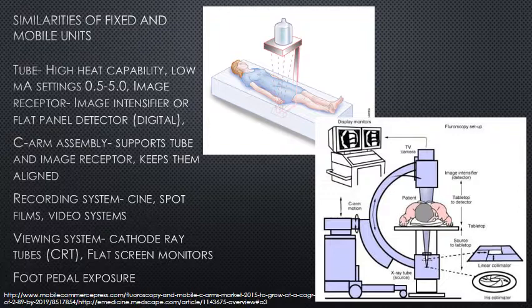So radiologic technologists are not medical doctors, obviously, so we actually should not ever be operating a fluoroscopic unit. It's really not allowed because we can't make a diagnosis off of a dynamic study, but you might be asked to use fluoro to find the terminal ileum on a small bowel study and then to take a spot image.